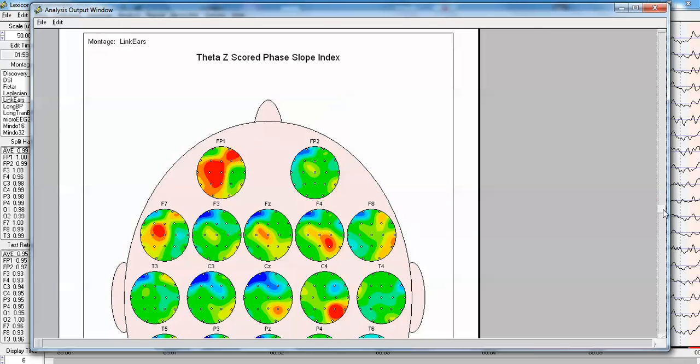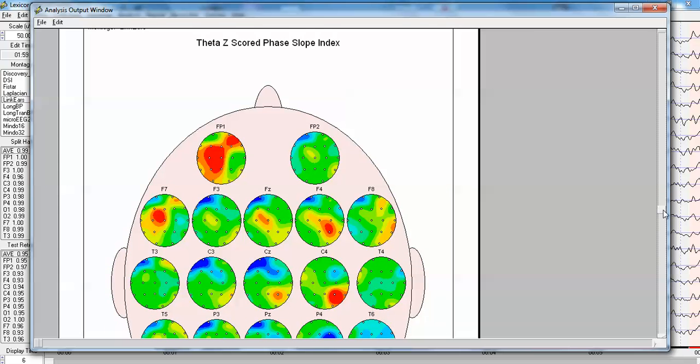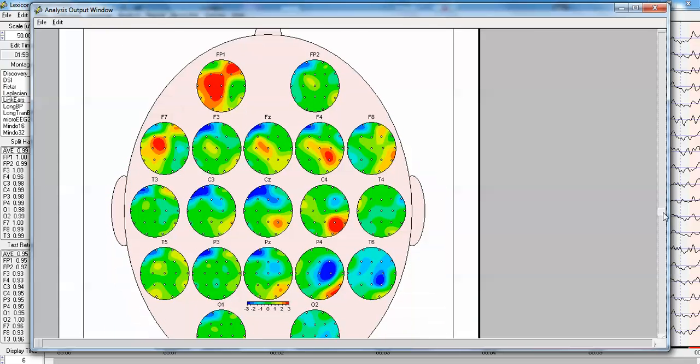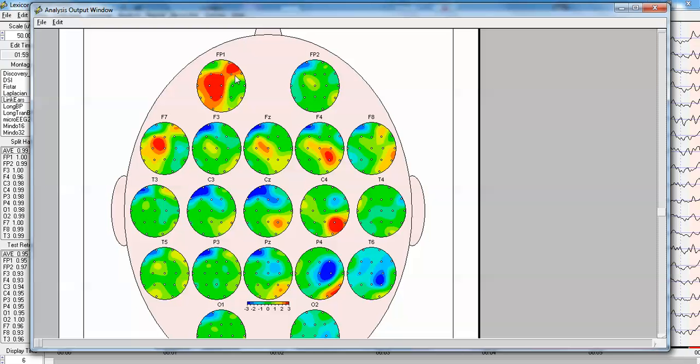Let's take a look at the theta, where it's the greatest deviation from normal. And what we see here is that the left frontal has information flow to the right frontal, as well as to FP1, to F3, FZ, T3.